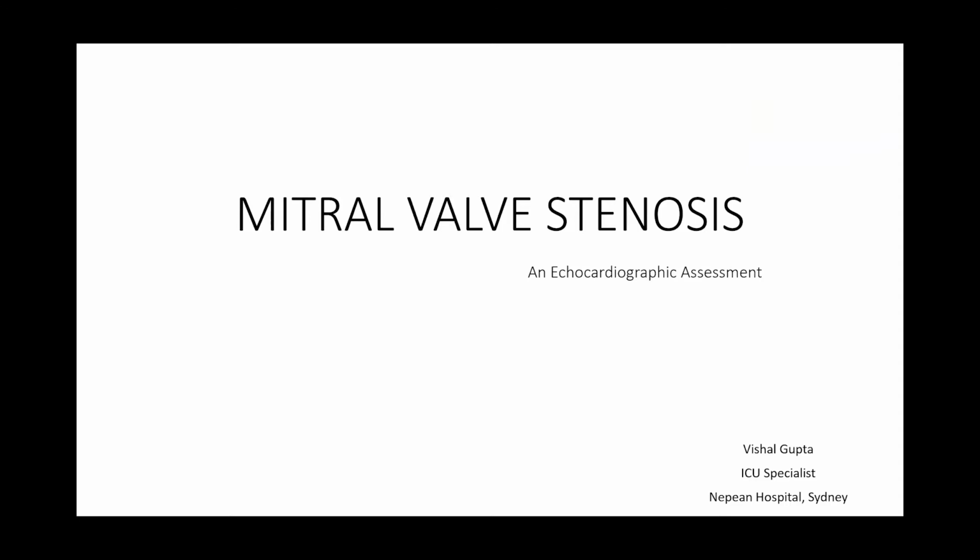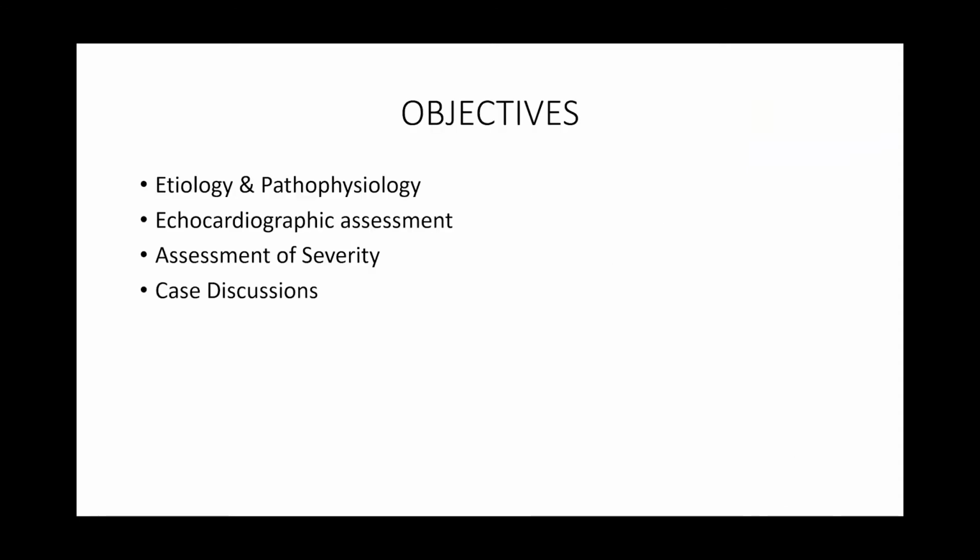So today we will be talking about mitral valve stenosis. In this talk, we will be talking about the etiology, pathophysiology, and then how to do an echocardiographic assessment, and then how to assess the severity, and then we'll be discussing a few cases as well.